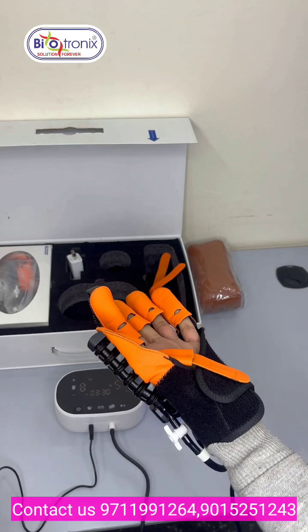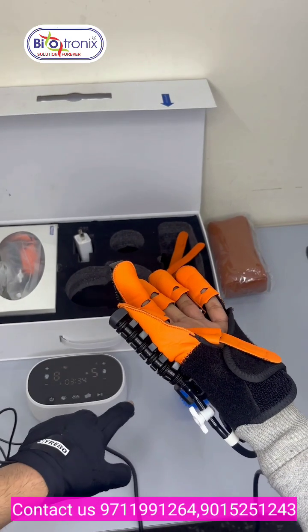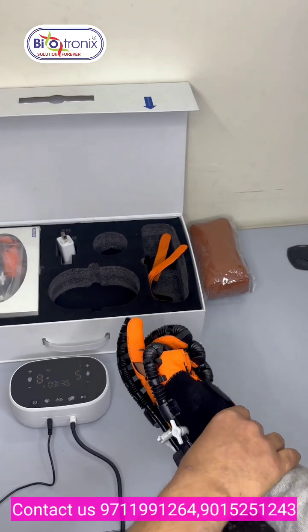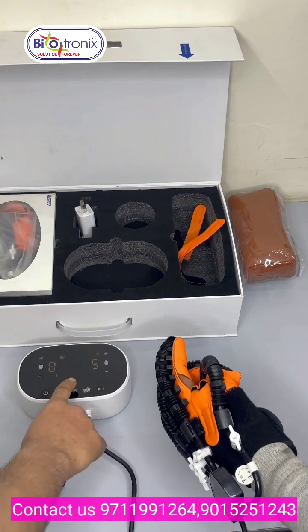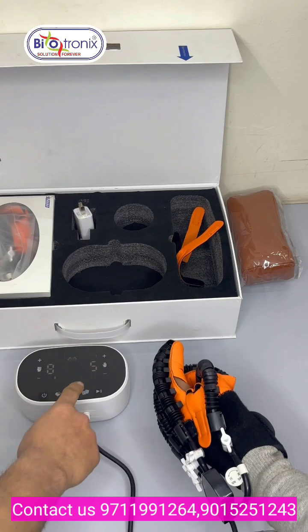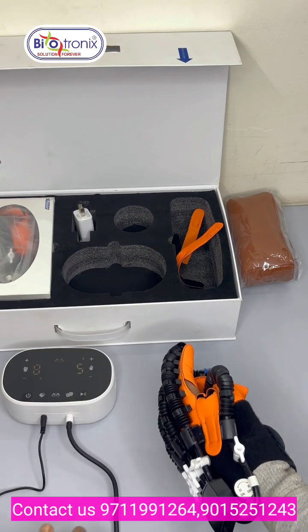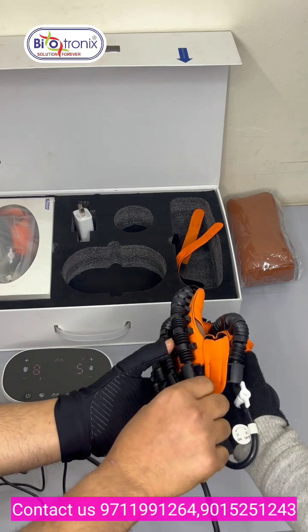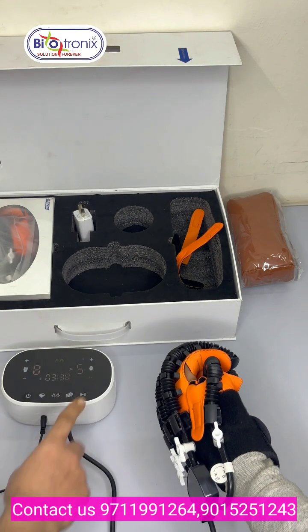Now ADL training can also be performed with the same. You can see that spike ball is there, and the patient will bring the hand over there, and I will switch off the same and put it in the mirror training mode. Now the patient will bring the hand over here. I'm just opening the valve again. So now I'm starting the same.